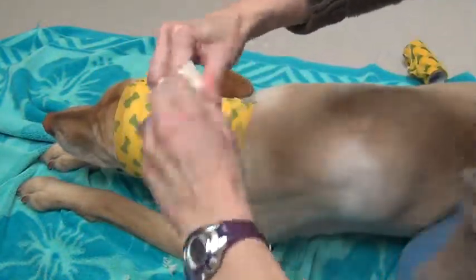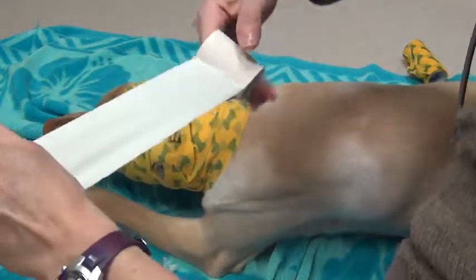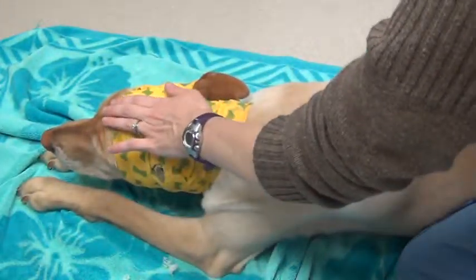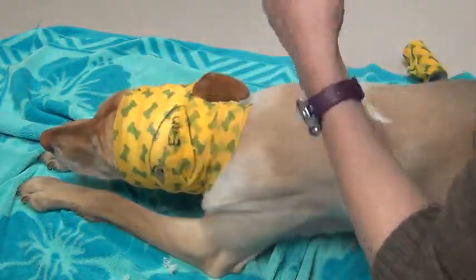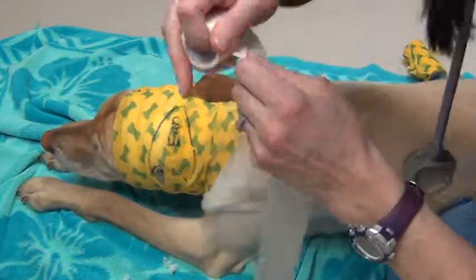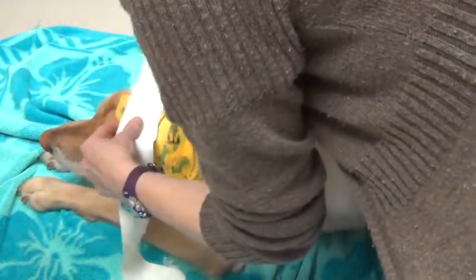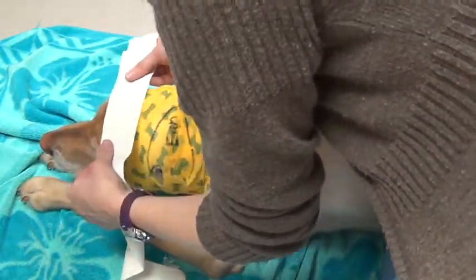So we're going to go ahead and use our 2-inch tape now. I'm going to secure the vet wrap on with just a wide piece here at each end. And you've got to be careful also with this one not to apply your tape too thick or tight. So I'm going to go halfway onto our bandage and then halfway onto her fur.